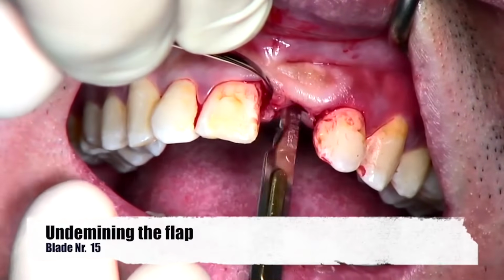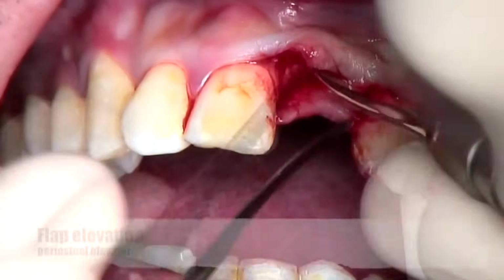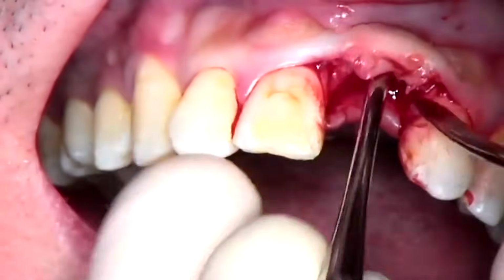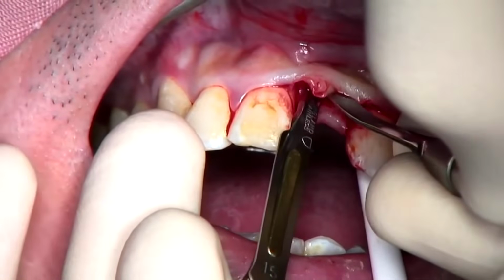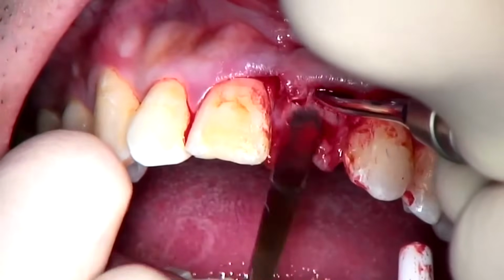Once the bone is initially exposed, we can begin the flap elevation with the periosteal elevators. A thin and sharp elevator might be needed for the thinner and more fragile buccal flap, while a wider elevator will be used often on the palatal side.